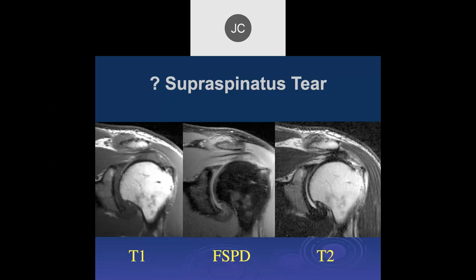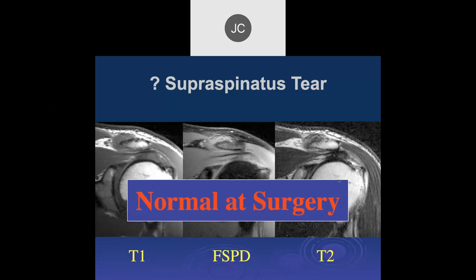Question of supraspinatus tear: I think there is a near full-thickness defect of the bursal side. The musculotendinous junction appears retracted by about a centimeter and a half — this looks like a full-thickness tear. But when the patient went to surgery, this was normal. I would still call it a complete full-thickness tear. This may be a case where there's scarring and the arthroscope couldn't get far enough to actually see the tear.